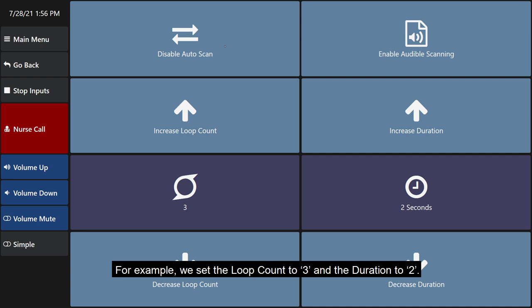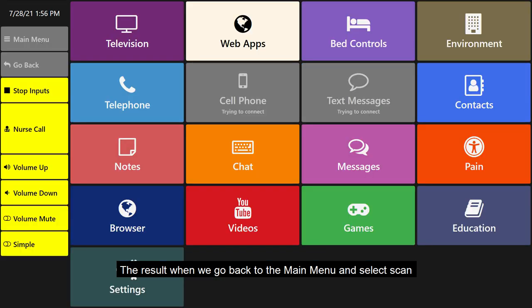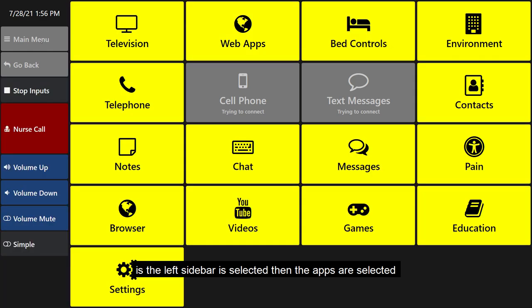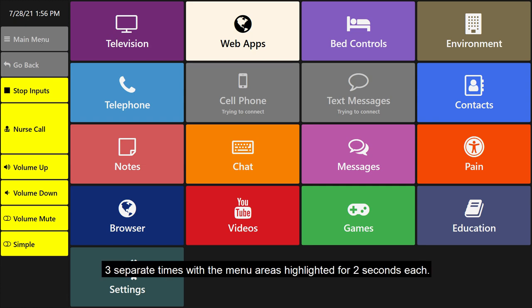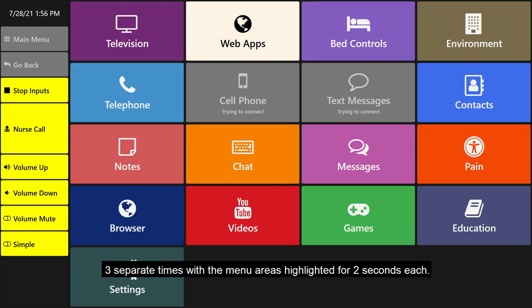For example, we set the loop count to 3 and the duration to 2. The result when we go back to the main menu and select scan is the left sidebar selected, then the apps are selected three separate times with the menu area highlighted for 2 seconds each.